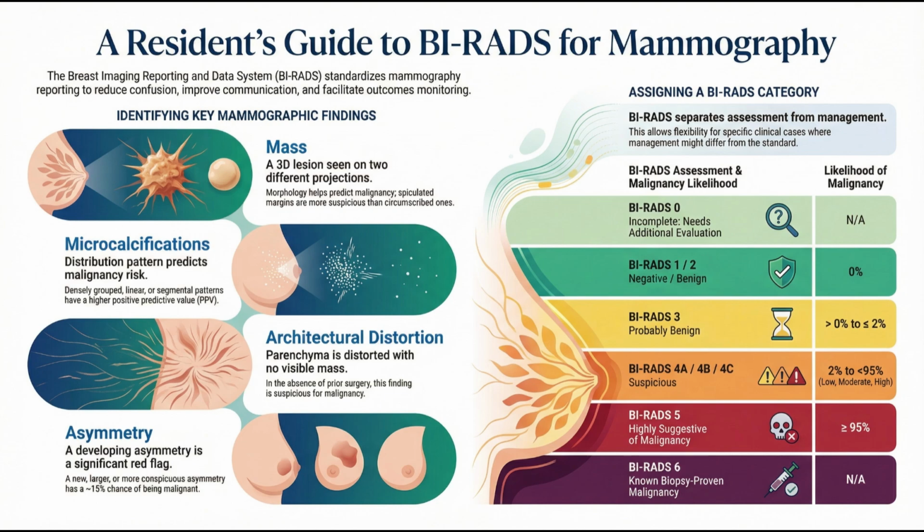It means we see these tiny radiating spikes spreading out from the mass. And what are those spikes physiologically? Why is that word so concerning? Those spikes are the visual proof of the tumor actively invading. It's pulling in the surrounding fibrous tissue. It's not just growing and pushing. It is aggressively infiltrating the structures next to it. Wow. And that's why spiculated margins immediately escalate the concern. They correlate very strongly with malignancy. That distinction, pushing versus pulling, is such a powerful way to think about it.